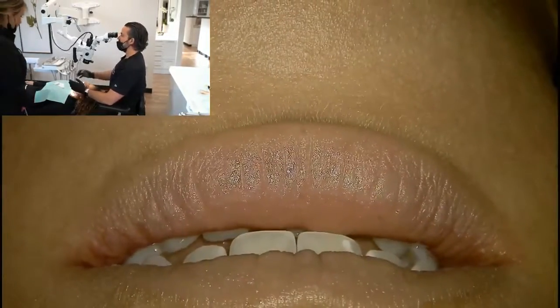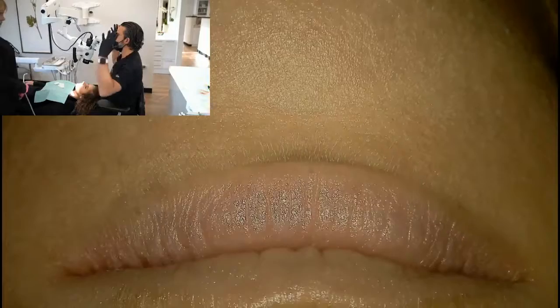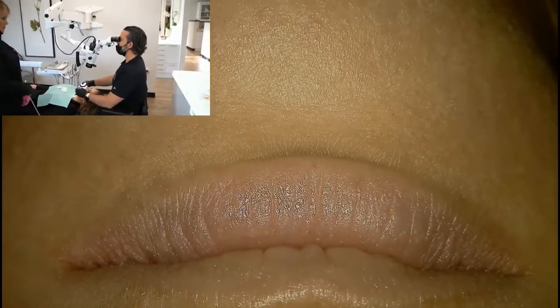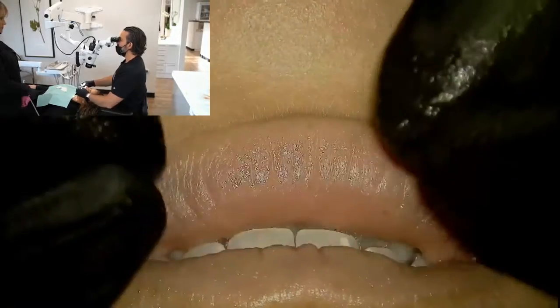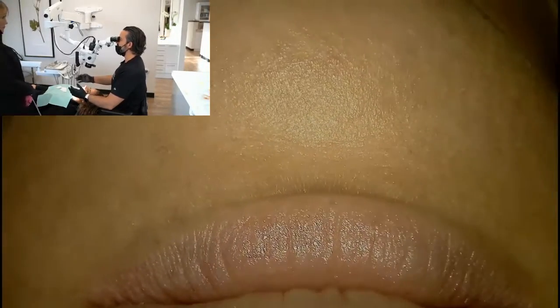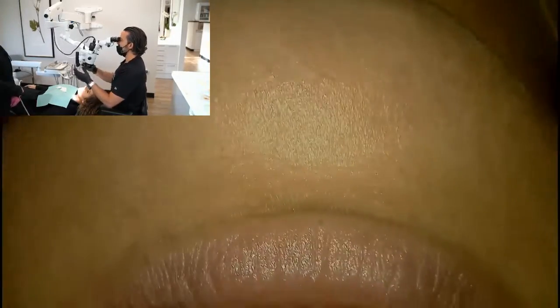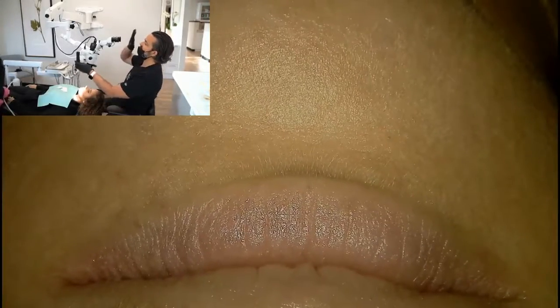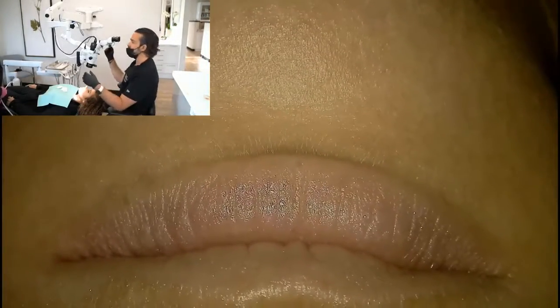But one thing is if you have these cups, like I said, it blocks the light and the room around me becomes very small and I can work. But sometimes you'll start using your eyes to push things around as you're trying to see, and then you're constantly refocusing. So other people like to push those things away.